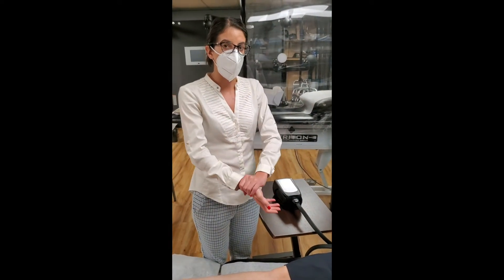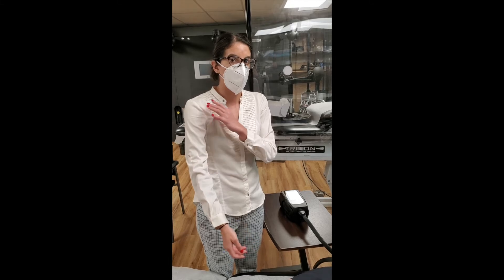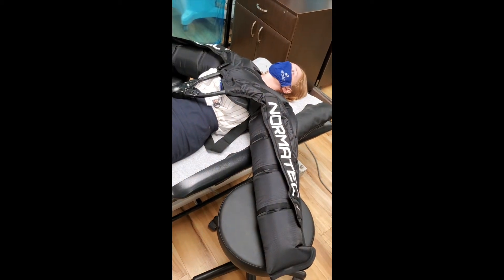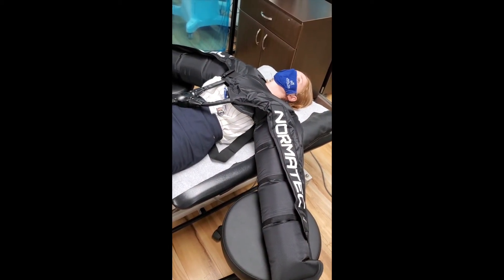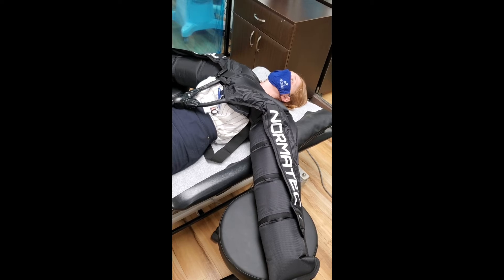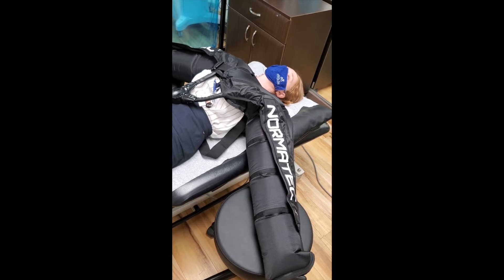The great thing is that as it works up proximally towards the heart, it doesn't release the distal pressure, so the blood cannot flow backwards — it keeps the blood flowing in the right direction toward the heart. I can feel it now closer to my chest, from my fingers all the way up. There's no pain, it's very comfortable, slowly inflating and giving that compression to reduce the constriction.